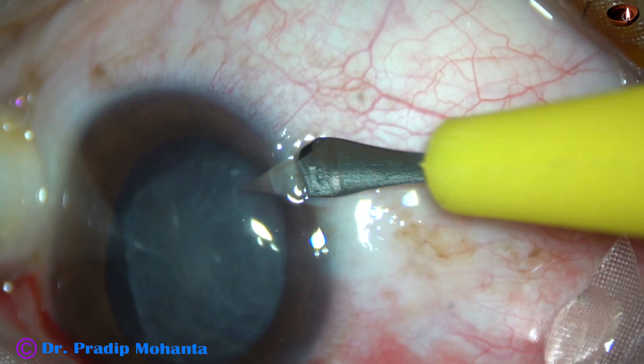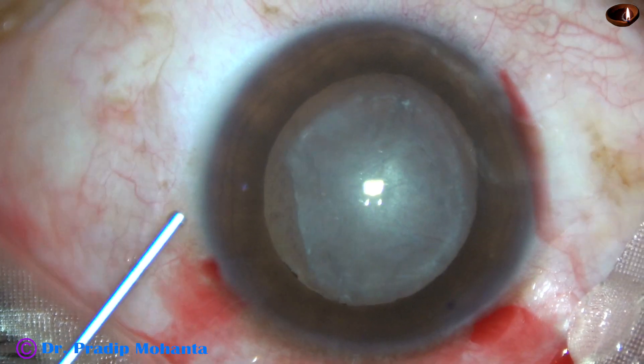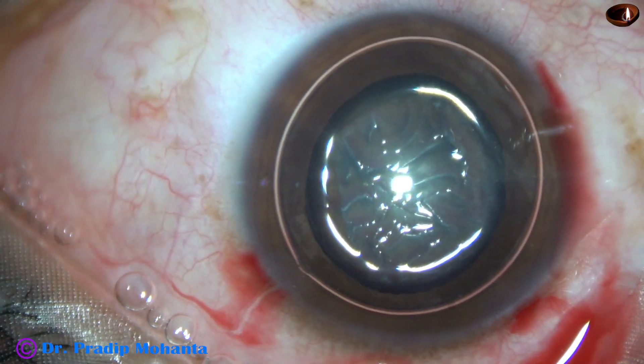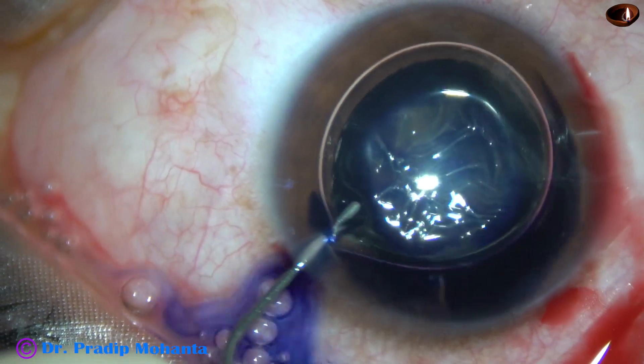Now let us observe this surgery. By this time all the incisions have been made, and now an air bubble is injected. Beneath this air bubble, trypan blue dye is applied over the anterior capsule.